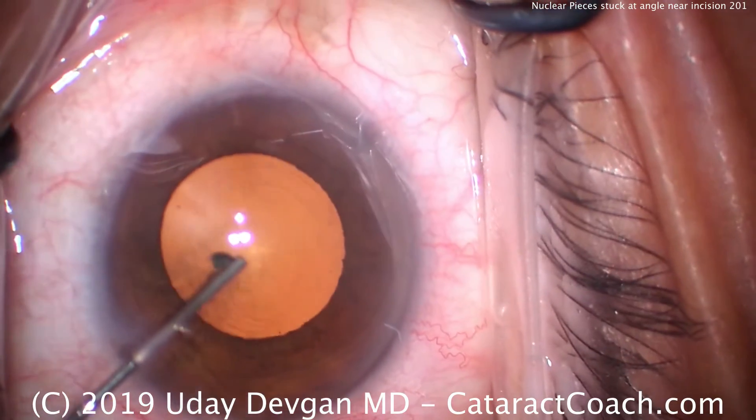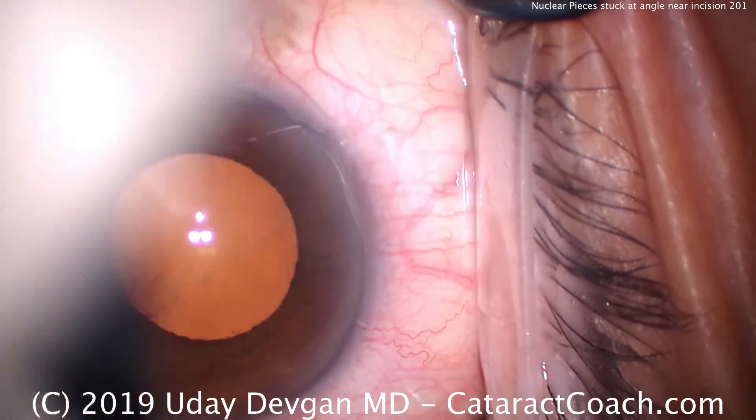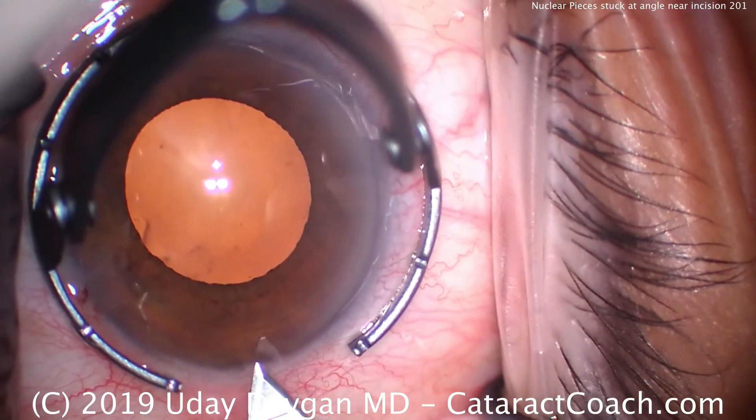If you want to see just that part, please skip ahead to about the two and a half minute mark, and you'll see what we do. Otherwise, for the rest of you, let's watch the routine case here. There's a lot to learn.